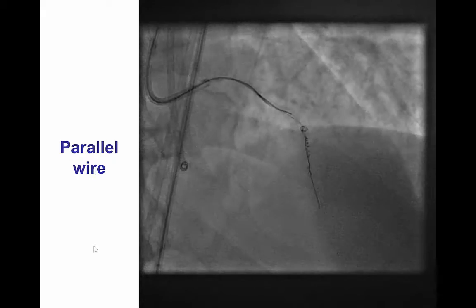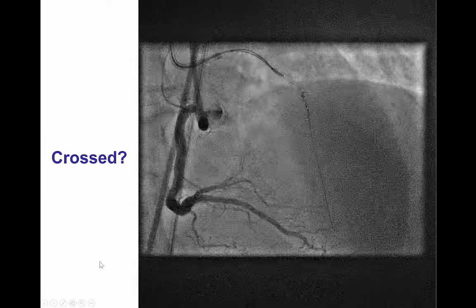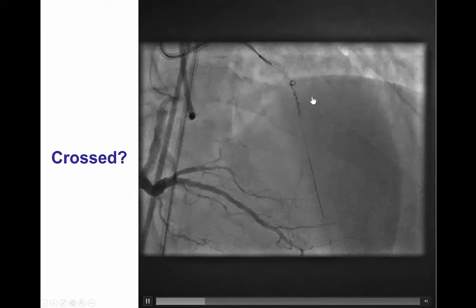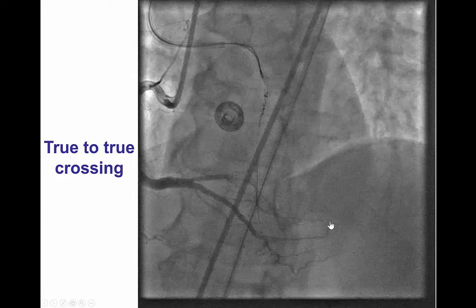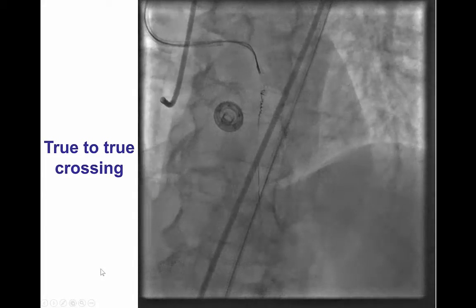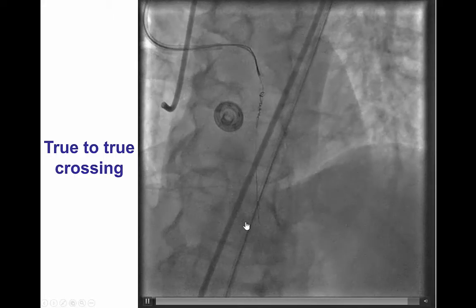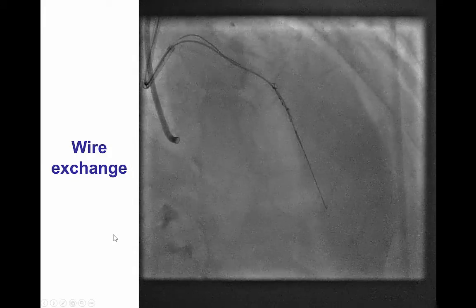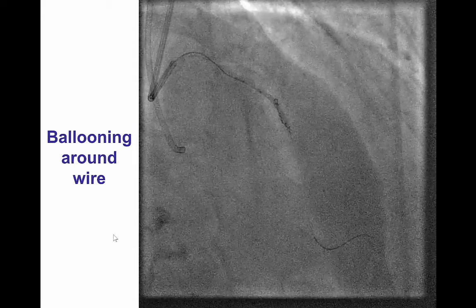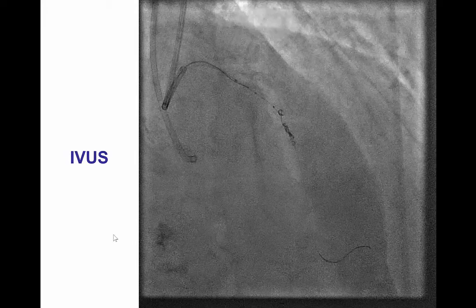However, we were still stuck in the microcatheter. What we tried to do next was advance a guidewire next to this. So we did a parallel wire technique with the Pilot 200 and were actually able to advance distal to the area of the entrapped guidewire into the mid LAD with true-to-true lumen crossing as confirmed from two orthogonal projections. We now have the fractured guidewire with the Finecross microcatheter still attached and a second guidewire crossing in the distal true lumen — the Pilot 200 as a workhorse guidewire — then tried to balloon against the entrapped wire so we could remove the Finecross microcatheter and potentially place a stent in that area.